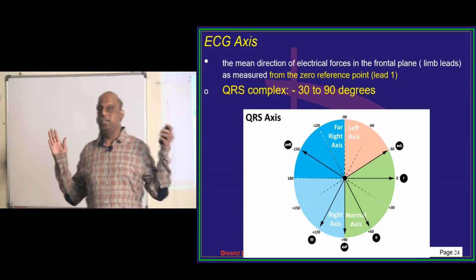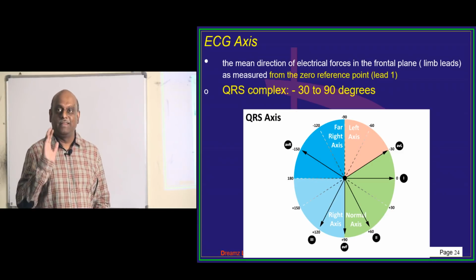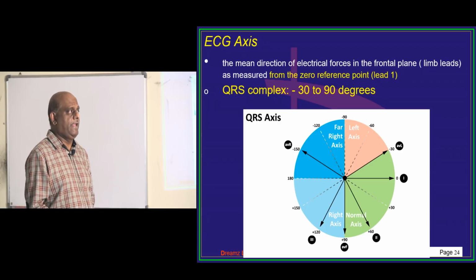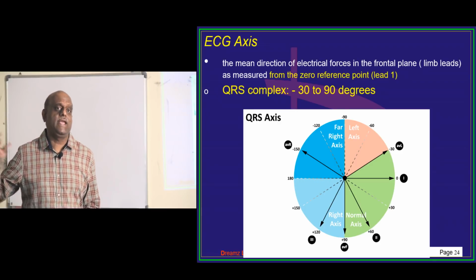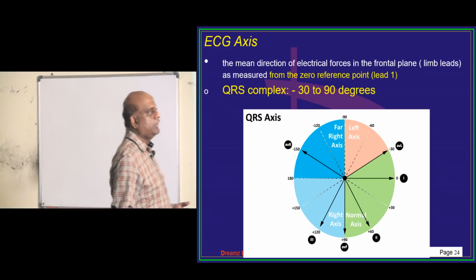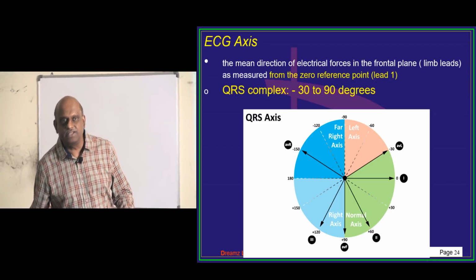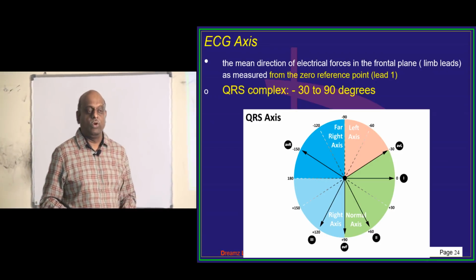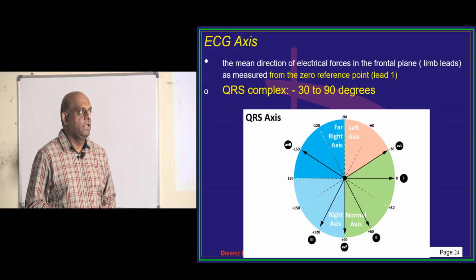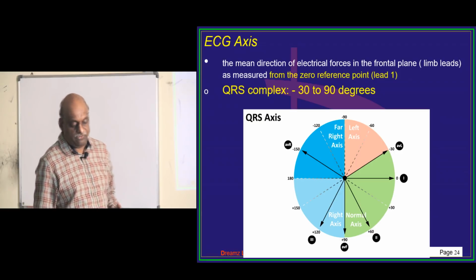We had been discussing ECG, the rate, the rhythm and SVT versus VT, the broad complex tachycardias. Till there we have discussed till now. Today we shall review axis, what are the causes of left axis and right axis deviation, and the importance of the Q wave. These are going to be the topics of interest today.